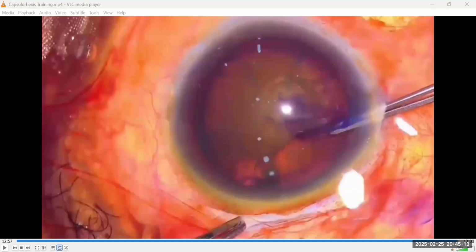All you're trying to do, just to bear in mind, is that any calcification of the capsule is not just about the capsule. The zonules might be involved. Any cataract that has such calcification, the person probably has poor vision on that side, must have been hitting the head here and there. So expect a bigger problem. So the calcification should be a pointer to a bigger problem. So me, I'll be more scared of the zonules than the capsule.